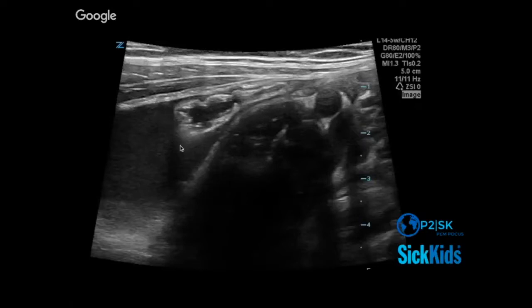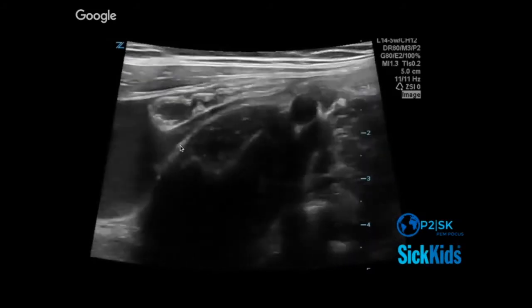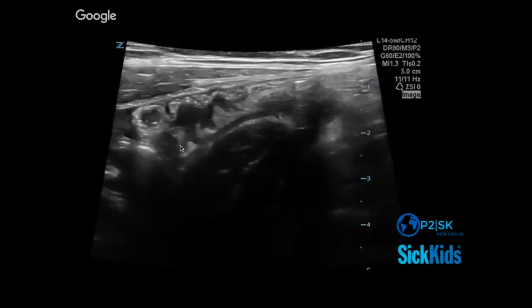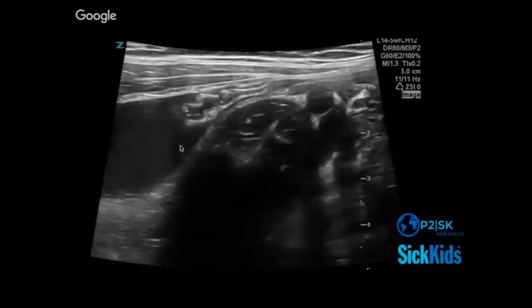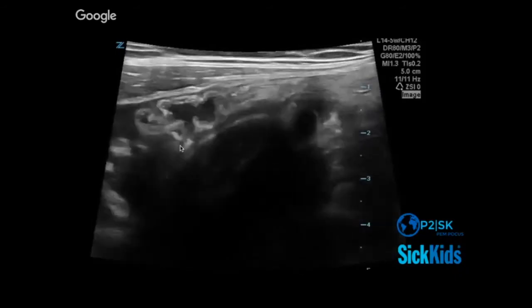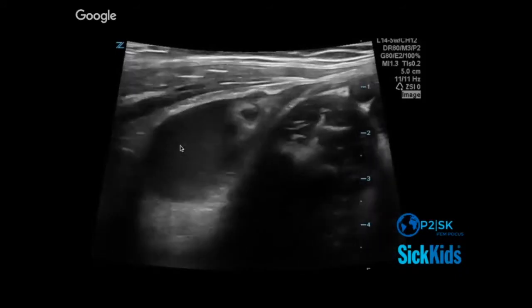Yeah, so I look at it and I say, is that within the cecum? Is it free? I can't really tell. And then I'll let the clip play. I get more convinced that I think it's turbid, free fluid. What do you guys think about the bowel wall itself? Yeah, it's bright, it's thick. And do you see any peristalsis?